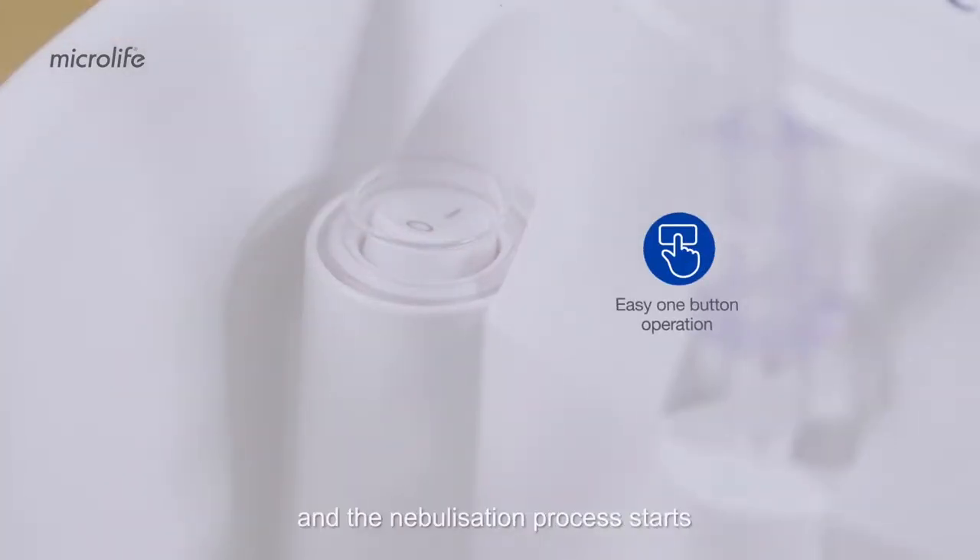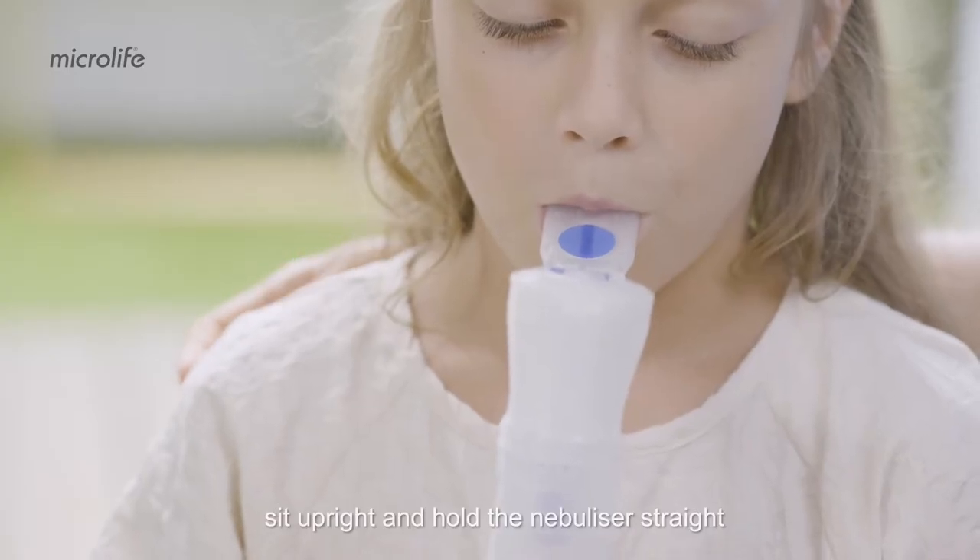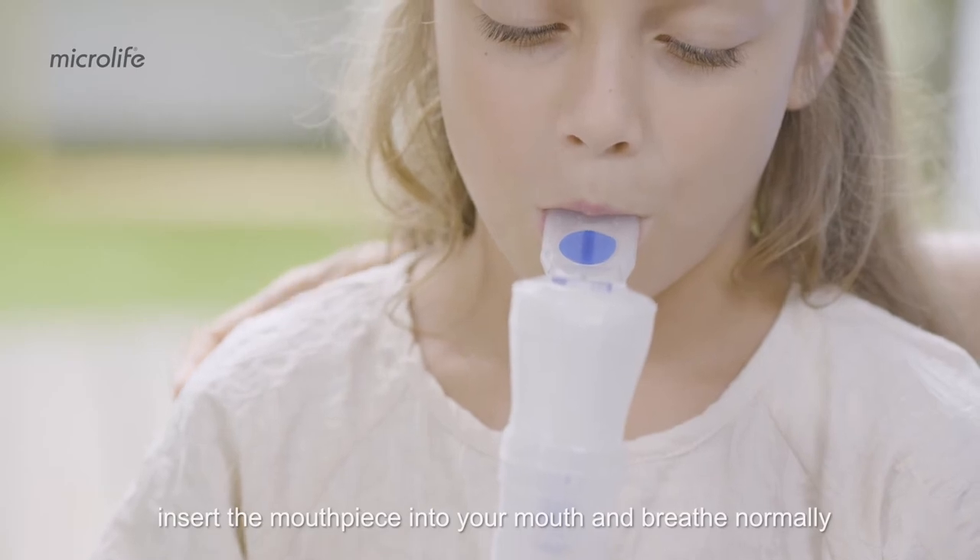Press the power switch and the nebulization process starts. Sit upright and hold the nebulizer straight. Insert the mouthpiece into your mouth and breathe normally.